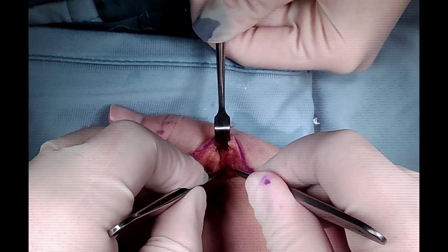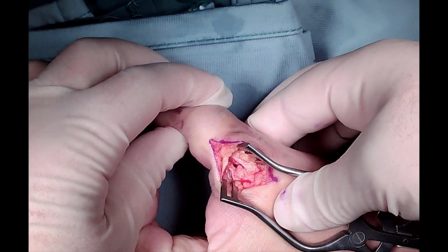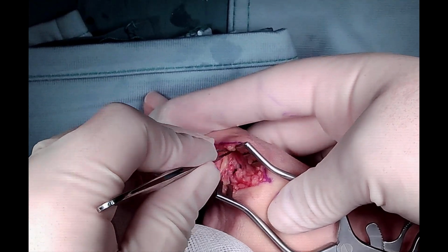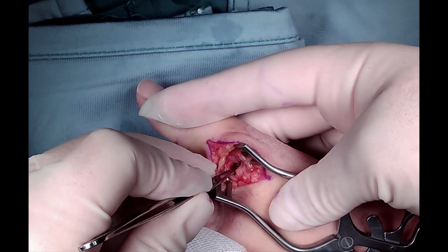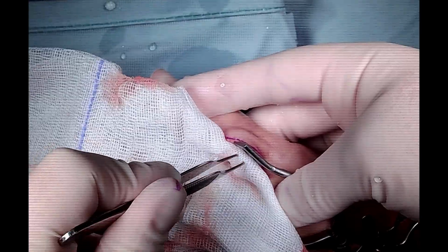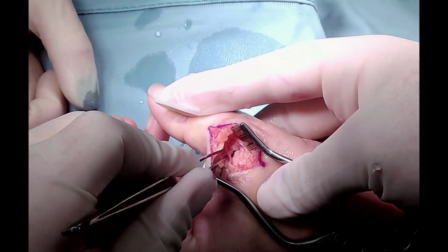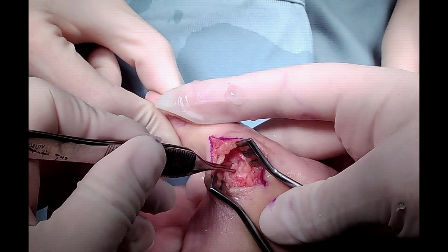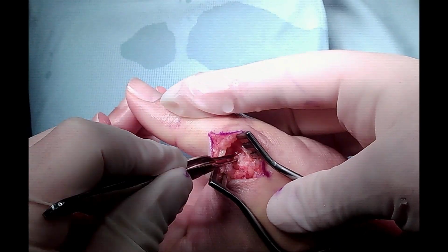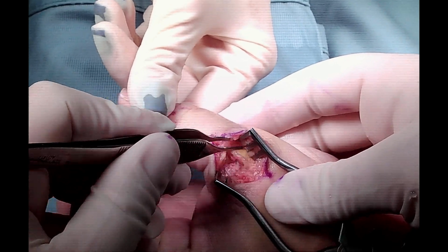Now we assess the injury. As we assess it more, we can lever the joint and see that the ligament is completely torn off and avulsed with a small fragment. Now the small fragment leaves a hole in the base of the proximal phalanx that will help us put the anchor in this hole, in this place, in order to anatomically restore the origin of the collateral ligament.